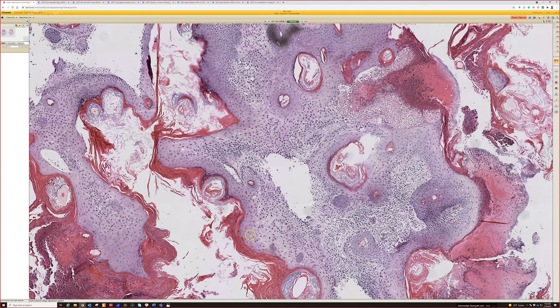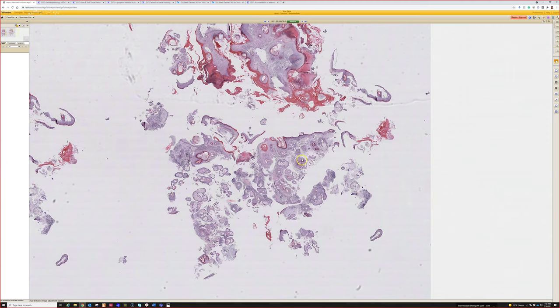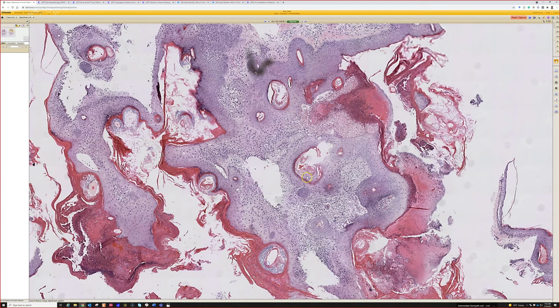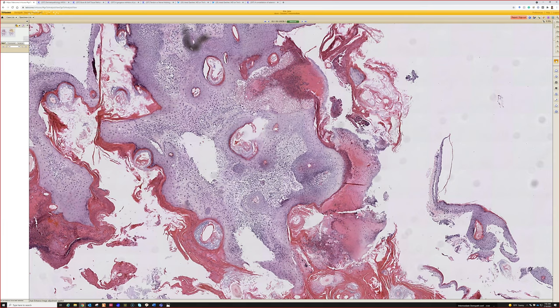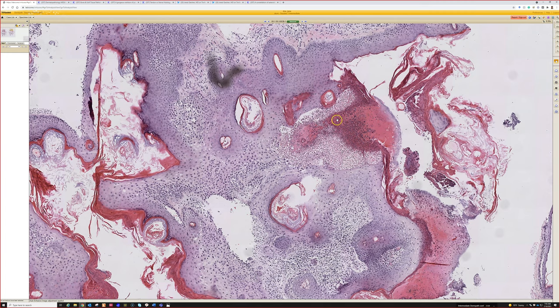This is what it looks like when you submit curettings — each little scrape is in here, and it's impossible to embed them in a way that they're all perfectly oriented like we can with a shave. You can't see what's up and what's down, so the histotechnologist can't embed it perfectly. Some pieces you won't see the epidermis at all, and others you'll see the epidermis cut at a totally tangential angle rather than the straight vertical perpendicular line we normally cut — sometimes at a 45-degree angle or even straight across the base of the epidermis.